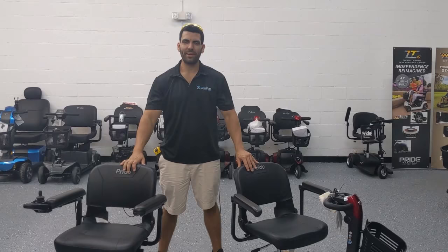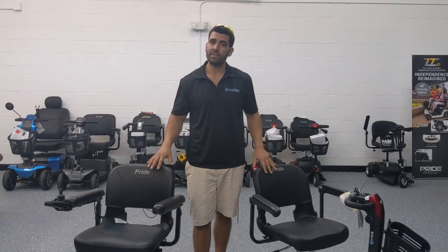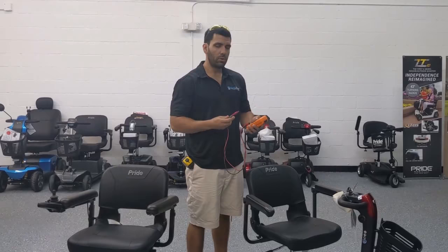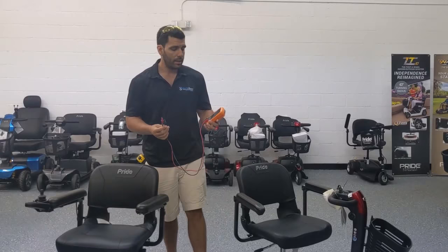Hi everybody, I'm Sergio with Mobility Scooters Direct, here today to show you how to diagnose your batteries on your mobility scooter — particularly a Go-Go scooter or a Go Chair. Most electric wheelchairs and mobility scooters can be tested in the same way. It's very easy. You do need a voltage meter; here I have a multimeter. You can get them at your tool store for around twenty to thirty dollars for a basic one that just tests voltage by putting the two probes on the positive and negative battery terminals.